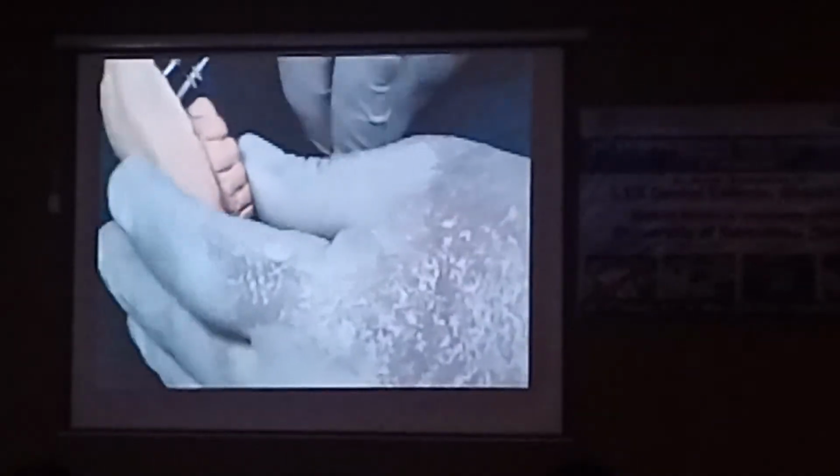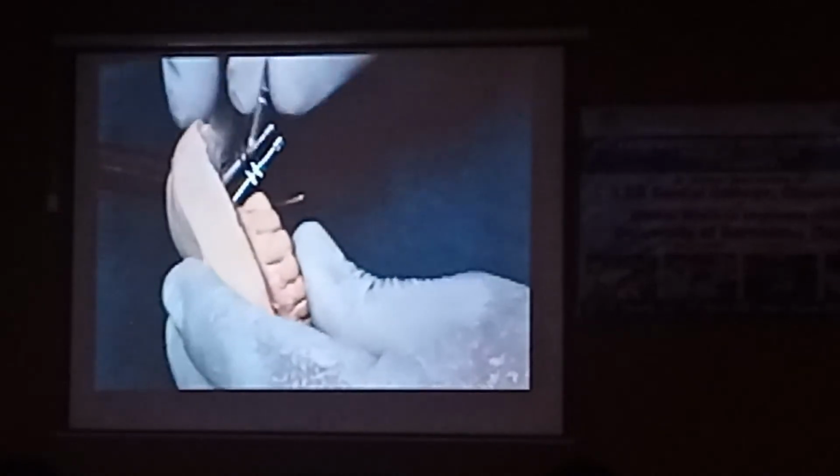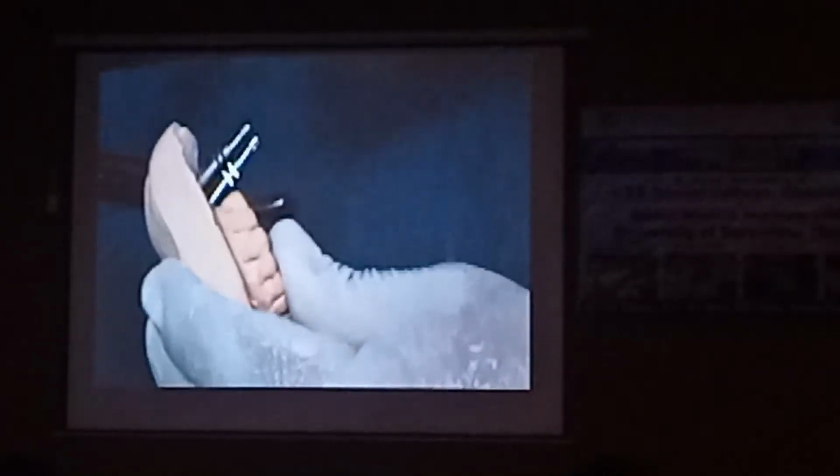So, tighten it, right? So, this implant positioning is right, this implant positioning is right. But are they right in relation to each other?